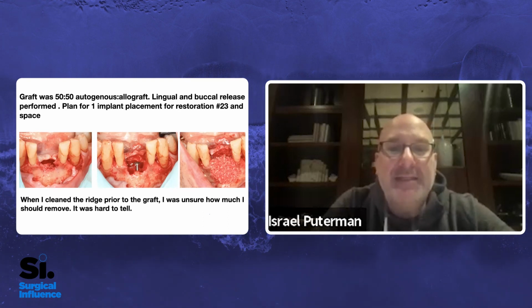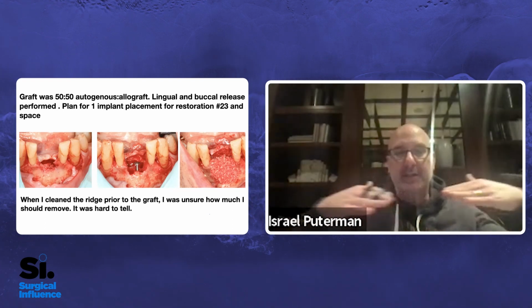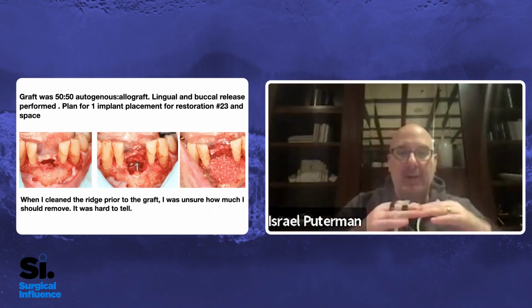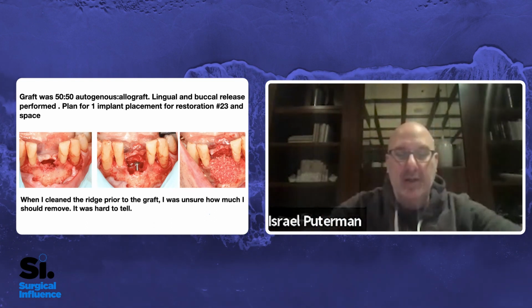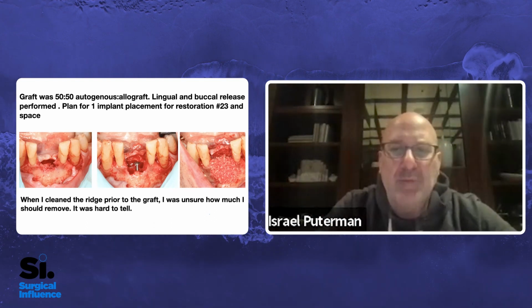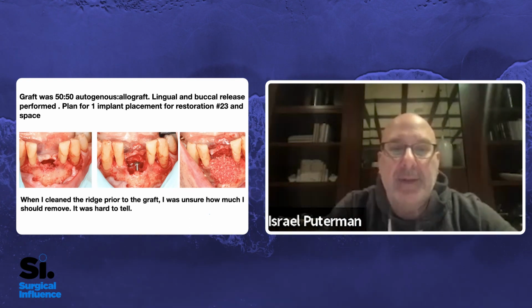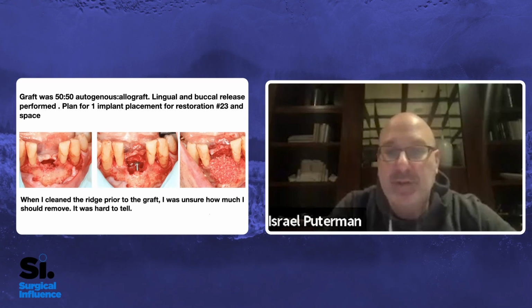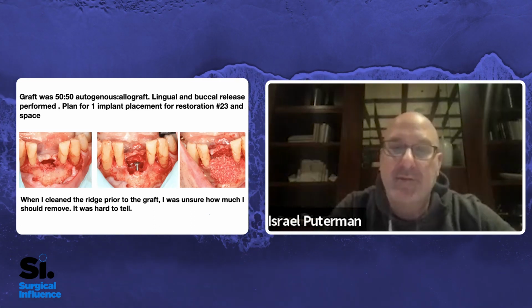Although I like this tenting screw, I like the width of the head because it kind of shields. It's not quite as narrow and comes out like an umbrella, so it lets the soft tissue lay with more support. So I do like that. But my personal preference, I like to use the full threaded fixation screws, but you can't go wrong if it works.